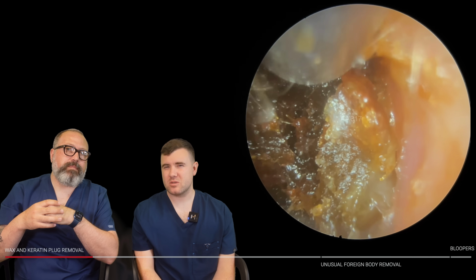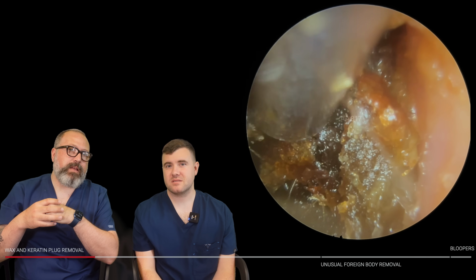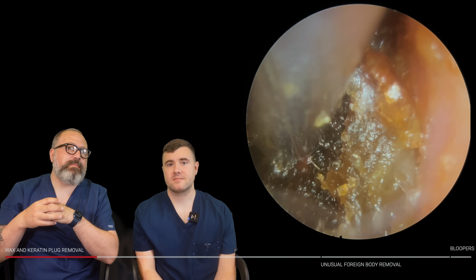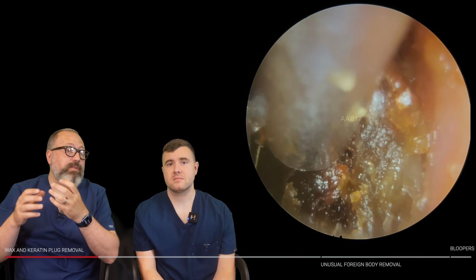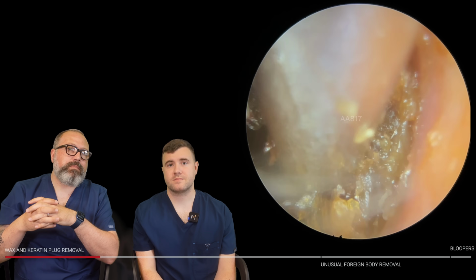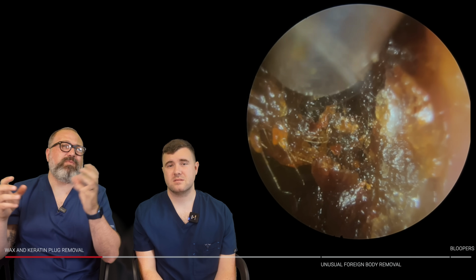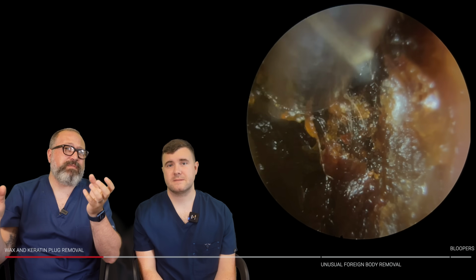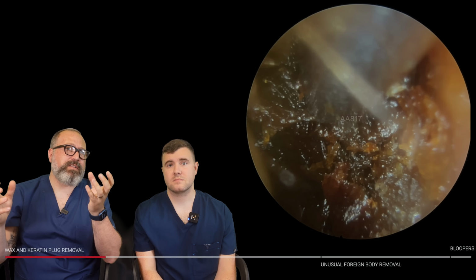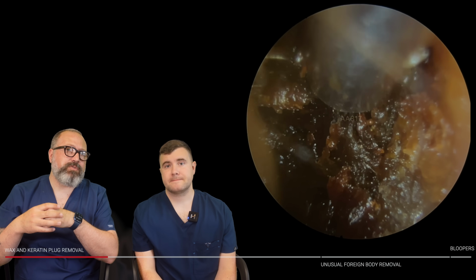This almost looks pre-keratosis obturans in a way. Yeah, that's thick, dead skin wrapping around that plug. I think if that plug wasn't there, it would almost be curling back on itself. Yeah. Just lifting from the bottom. And I'm looking for any gap because we've got that really awful combination of that thick clay wax and then this really hard keratin skin layer that's interwoven through it. So not an easy one to do by any stretch.